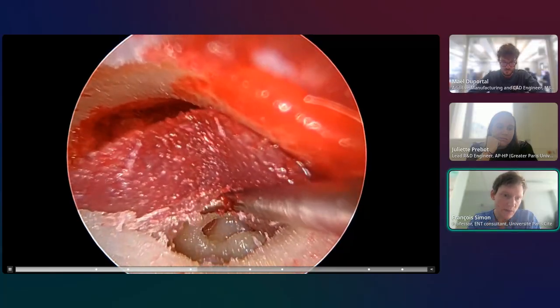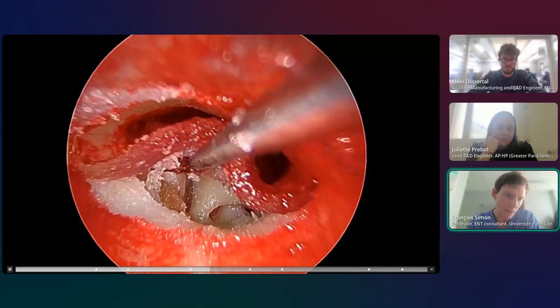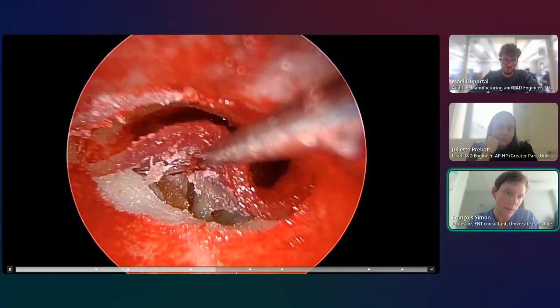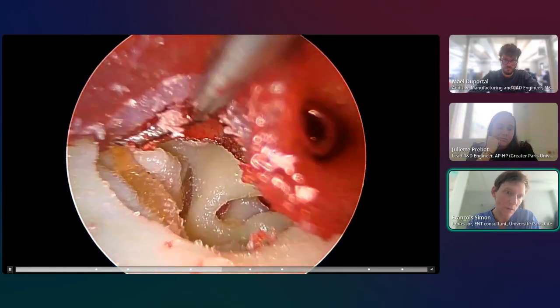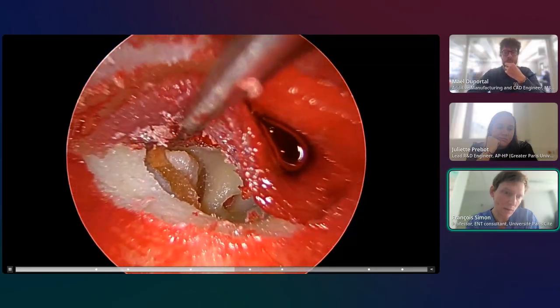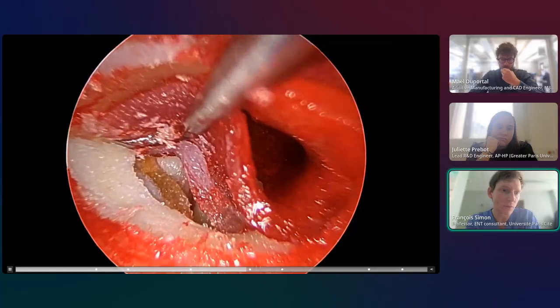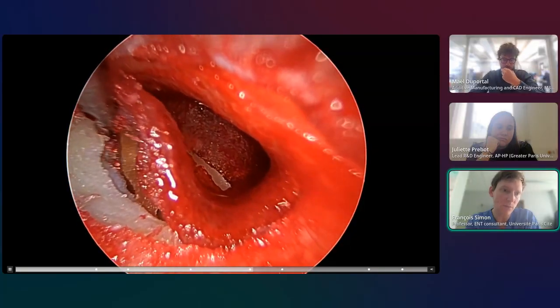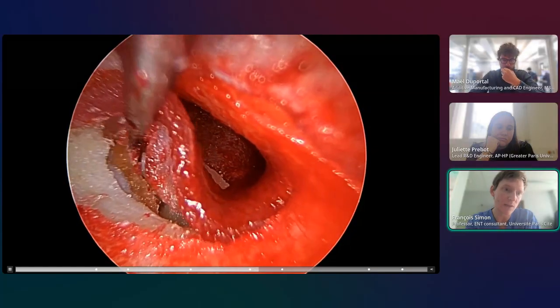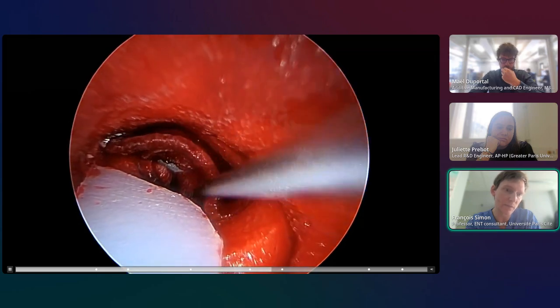So in this example, we're elevating the eardrum here, and we're accessing the structures behind the ear, and there you can see the ossicles. And so we're just going to move them a little bit. That's the chorda. So you can print, of course, with PolyJet the bone, but that's been printed for ages with different techniques, but also the soft tissues. And that's really innovation. That's very, very interesting for these different procedures.